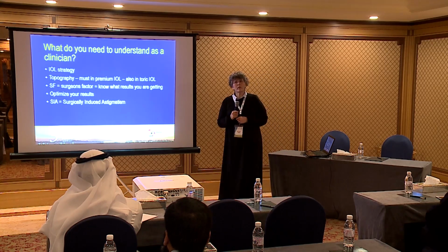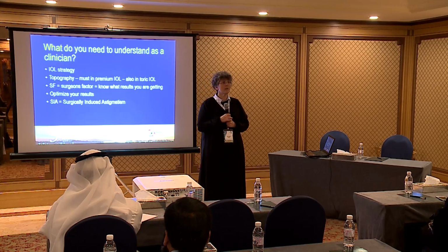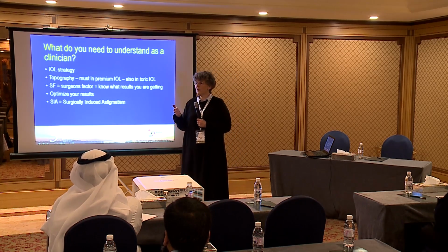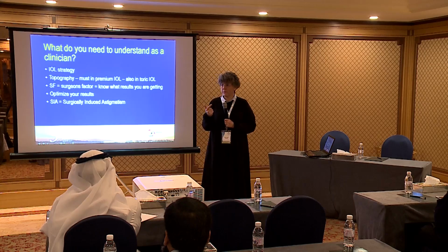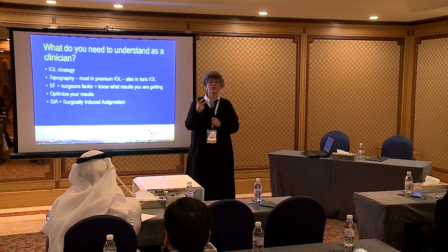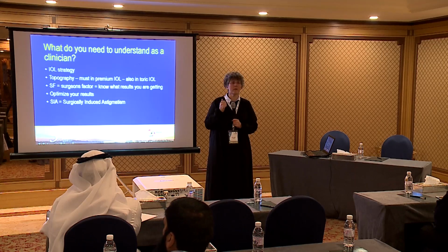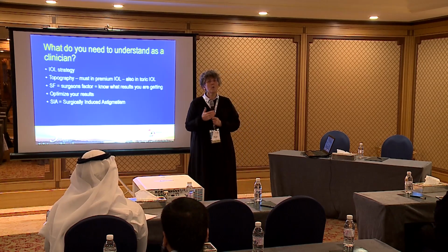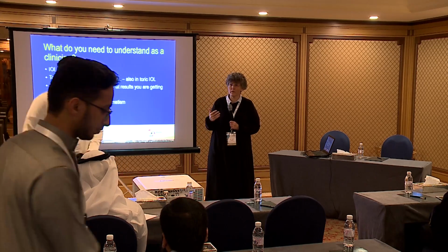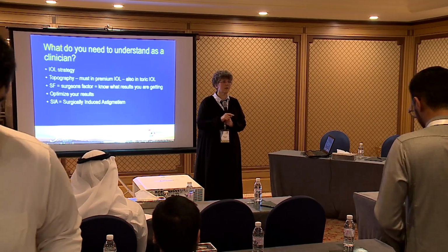So what do you need as a clinician? You need an IOL strategy that you do every time and again. You have to decide, when do I do topography? And this is all based on how much time you have, how many people to help you have, and if your system allows you to do as much as you would like to. For example, I work in 2 places. I work in an academic hospital, which is a very swamped place. We see lots of very difficult patients, and we will not do a topography in every patient unless we think there is a good indication.